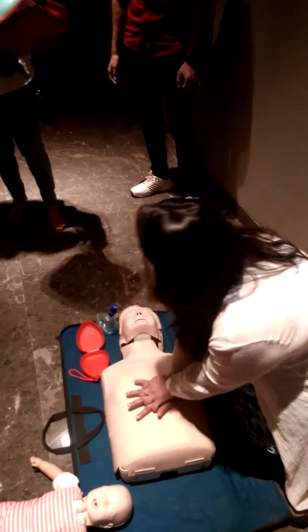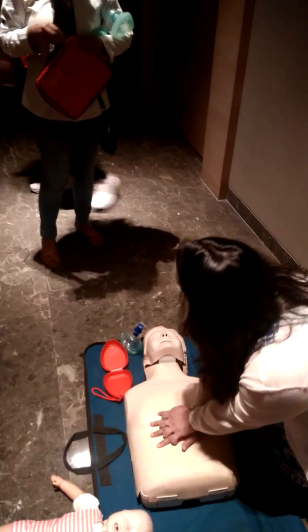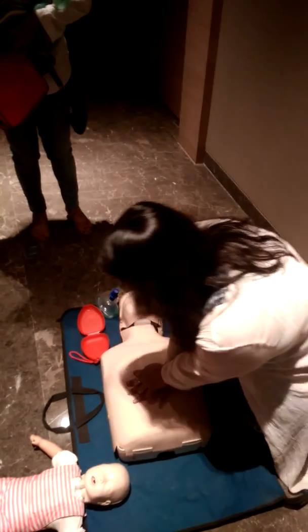Remember the rate should be at least 100 to 120. I have brought the AED.